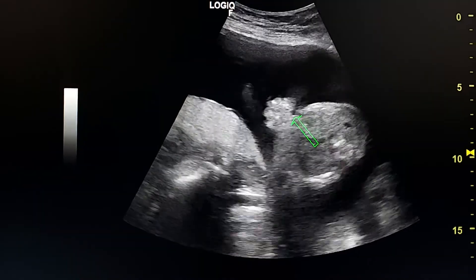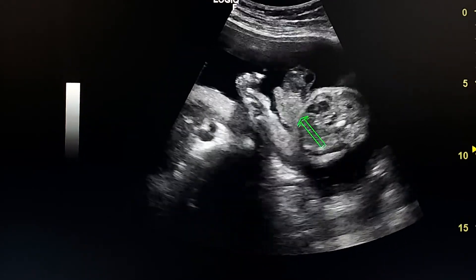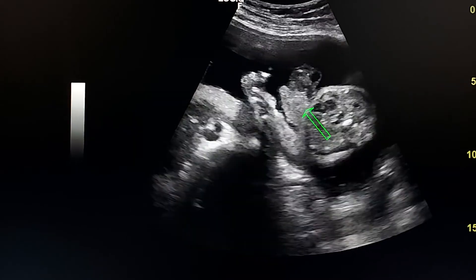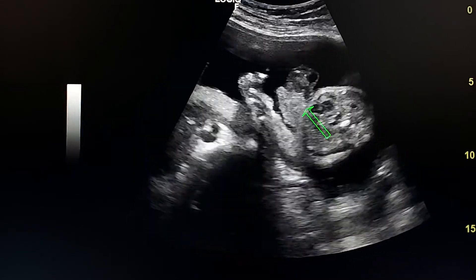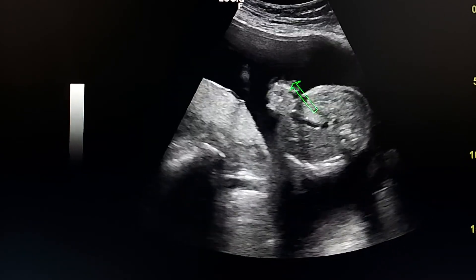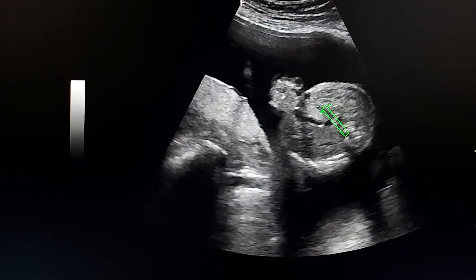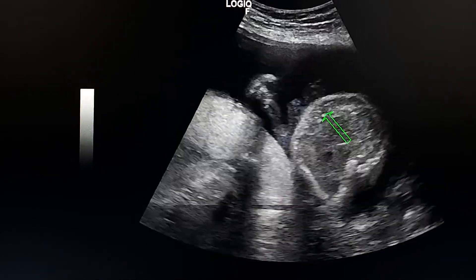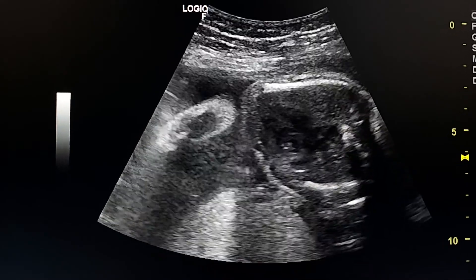Gastroschisis: here we see small bowel loops anterior to the abdominal wall. The heart appeared normal.